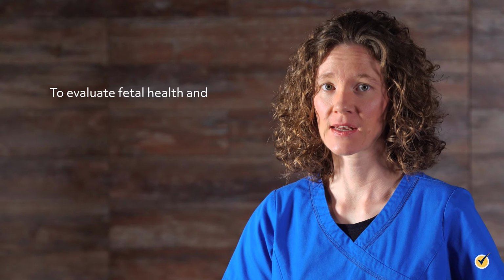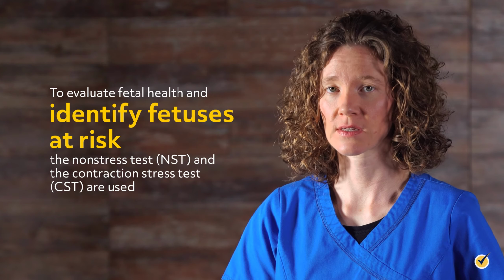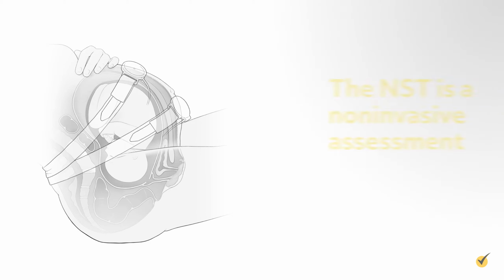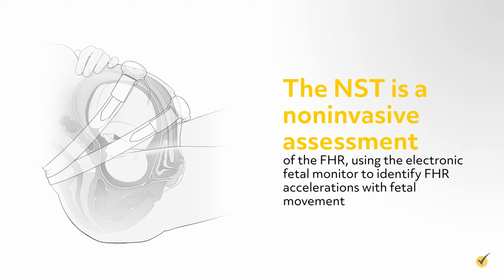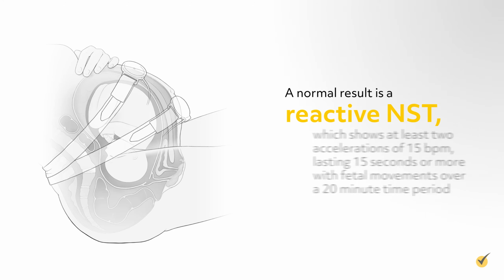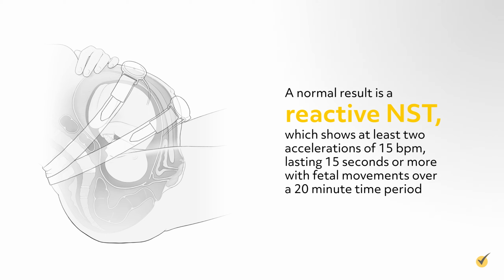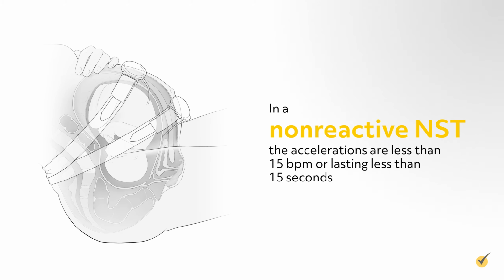To evaluate fetal health and identify fetuses at risk, the non-stress test, or NST, and the contraction stress test, or CST, are used. The NST is a non-invasive assessment of the fetal heart rate, using the electronic fetal monitor to identify fetal heart rate accelerations with fetal movement. A normal result is a reactive NST, which shows at least 2 accelerations of 15 beats per minute lasting 15 seconds or more with fetal movements over a 20-minute period of time. In a non-reactive NST, the accelerations are less than 15 beats per minute or lasting less than 15 seconds.